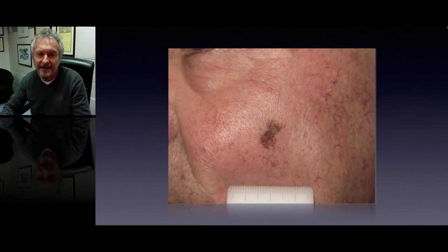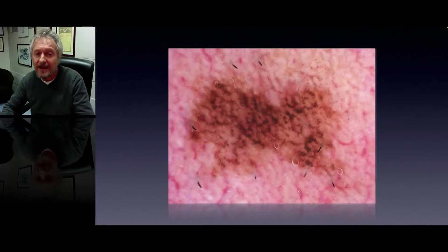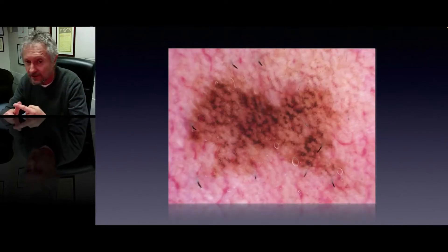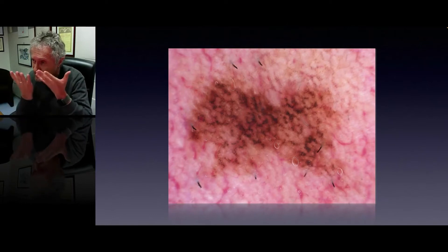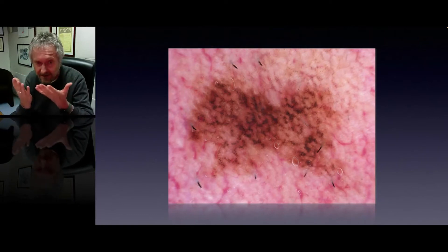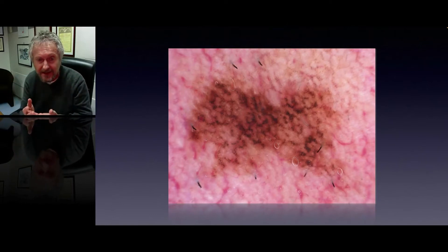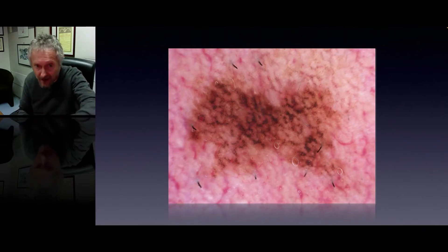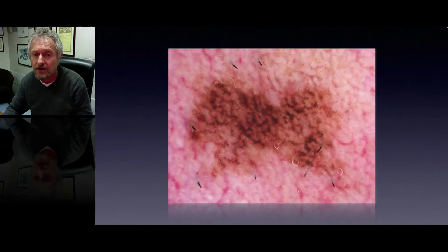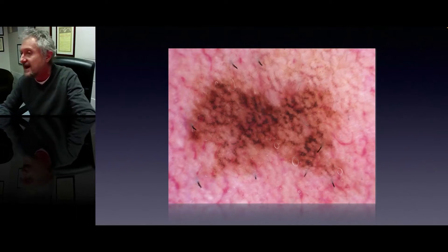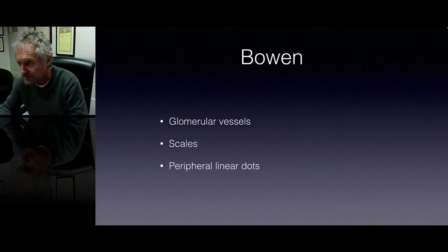Here is an example of a melanoma in which you don't see white follicles, you don't see superficial sharply demarcated pigmented lines, but instead you see gray color, rhomboidal structures, and an annular-granular pattern. So immediately you can realize that the morphology of melanoma is completely different.